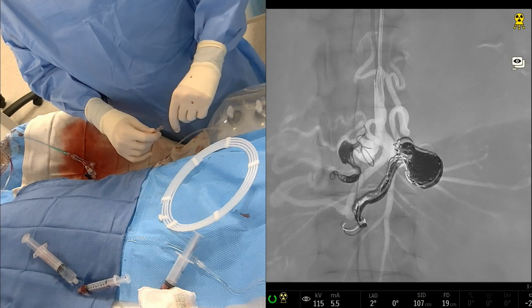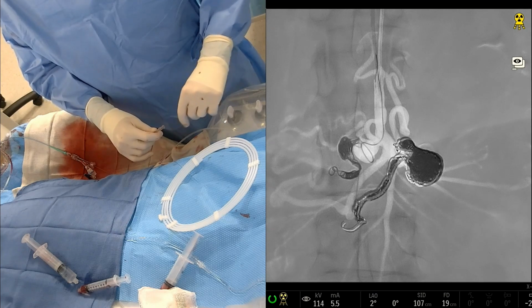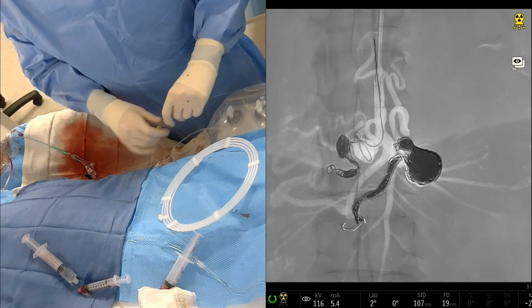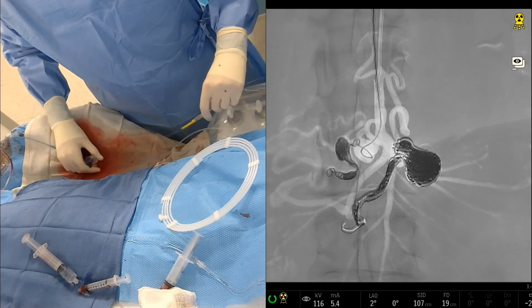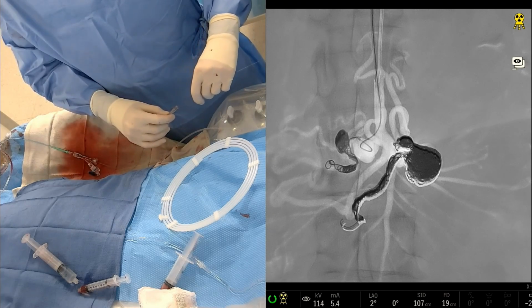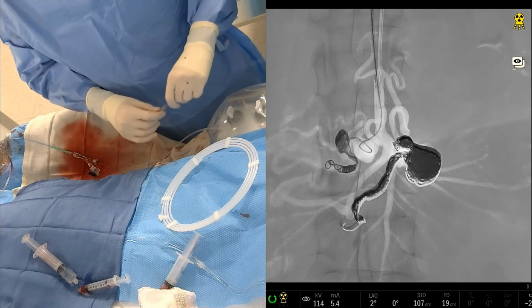This is incredible, Ed. You basically coiled that entire aneurysm with one coil. Yeah, it's great. You may have to pull it back, though. It's trying to go into a second aneurysm. There's a second outflow on the top of that first aneurysm there, and it looks like it's prolapsing into that, which is probably okay. You can let it prolapse. That's probably fine. It's not the end of the world.